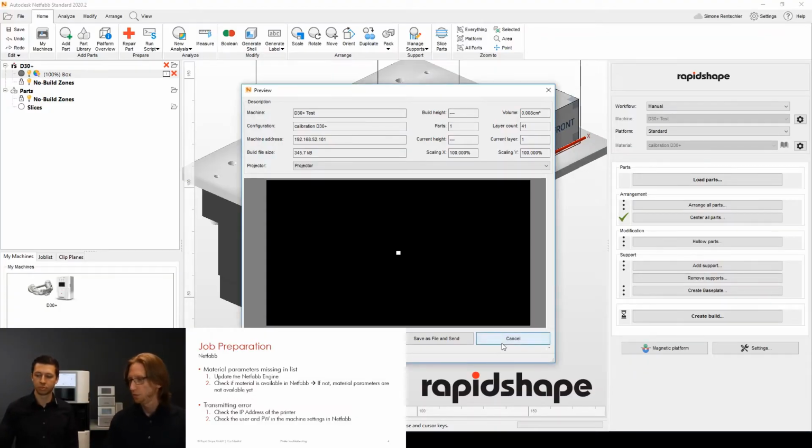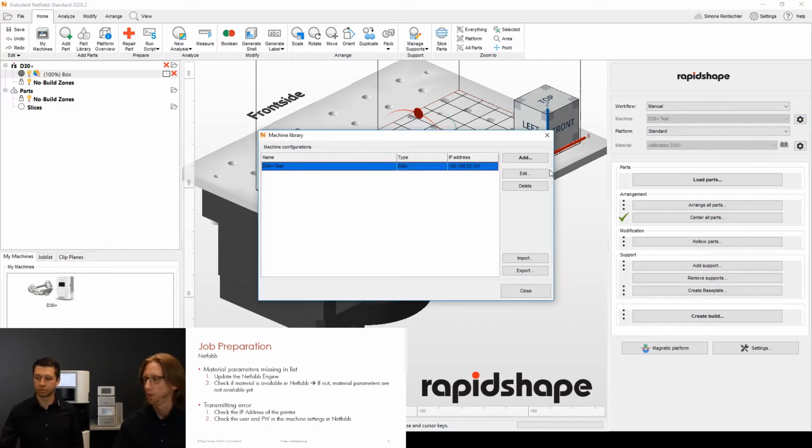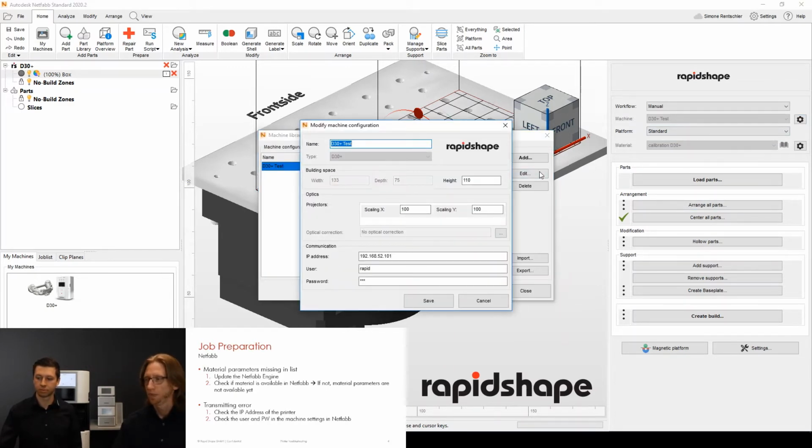Therefore, I just go back with cancel. Let's go to the machine settings and open the machine in here, and just get the information from the machine, which is also something we discussed in previous webinars. I think the best way now to check where to find the IP address on the printer would be the network section of the previous webinar.